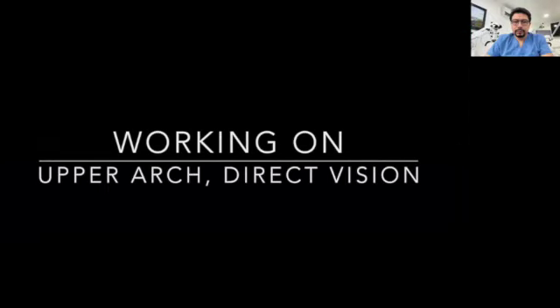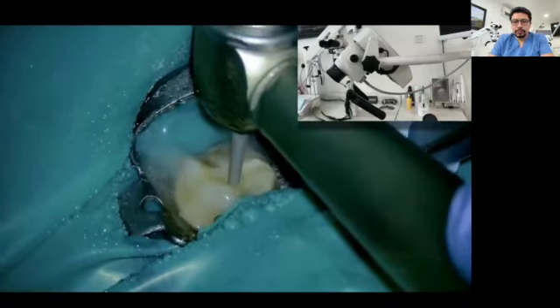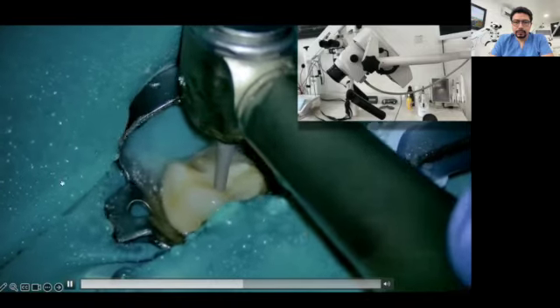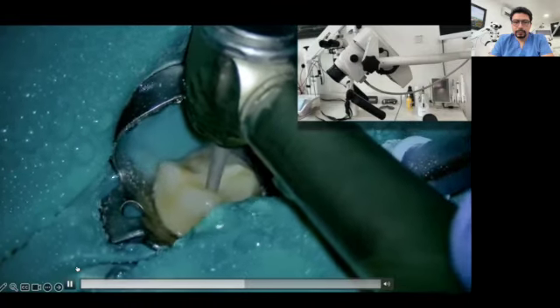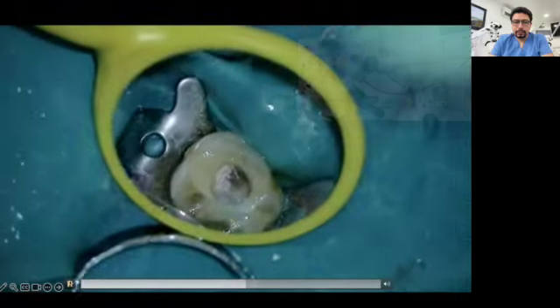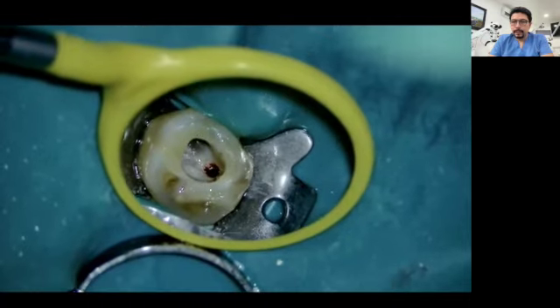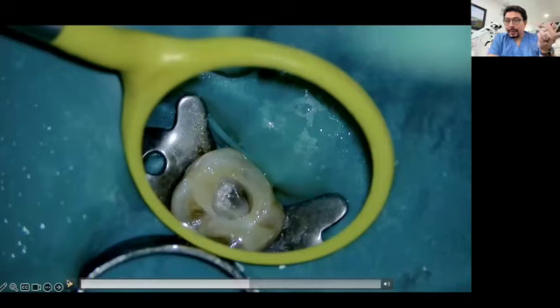Would you ever imagine doing an endo-access opening in an upper first molar with direct vision? Sounds crazy, but yes, it is possible. In this video, you are seeing an endo-access opening being performed with direct vision in an upper first molar. Then you just need to use the mirror for checking that everything is okay at the level of the pulp chamber floor.